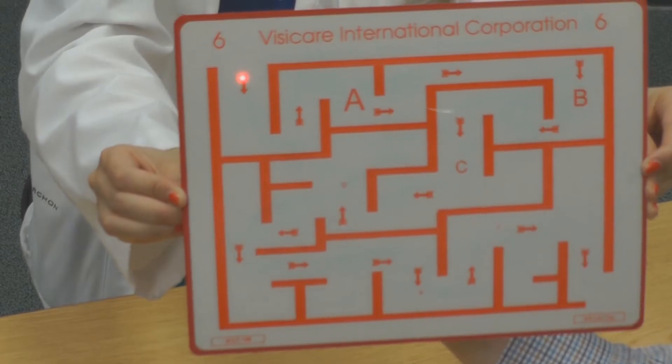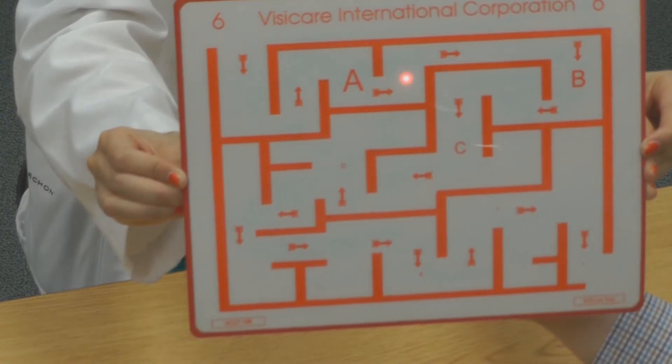Here we demonstrate what is seen with the red filter. The red filter sees the light itself, but does not see the lines on the paper. Generally, this is done with the red filter over the right eye.